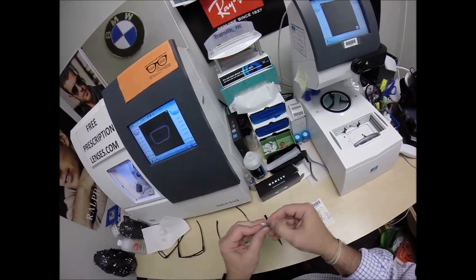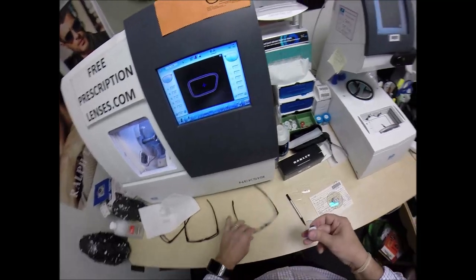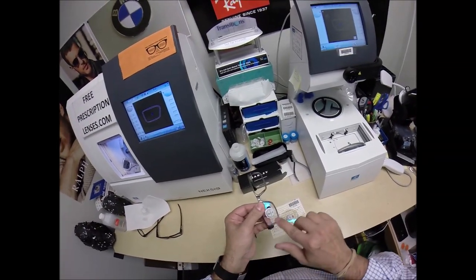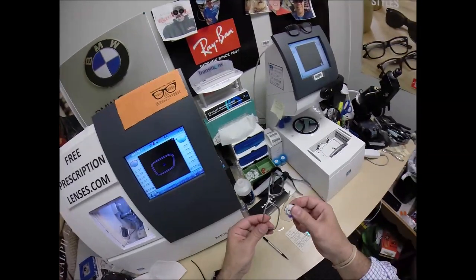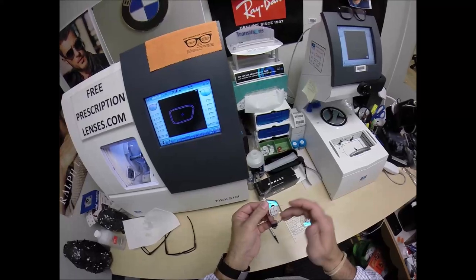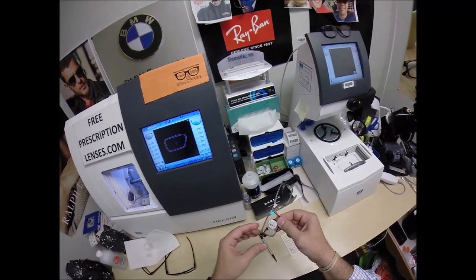So, I just want to clean all the sawdust off the edge of your lens. We're going to see if it fits into the frame first time around. Tuck it in at the outside corner. And years from now, should you ever need new lenses, well, we'll get back to that. Now, I have the side I'm working on closest to me, elbows touching my sides. Press down at the nose and it snaps right in.